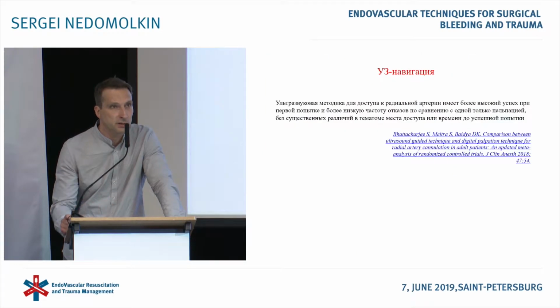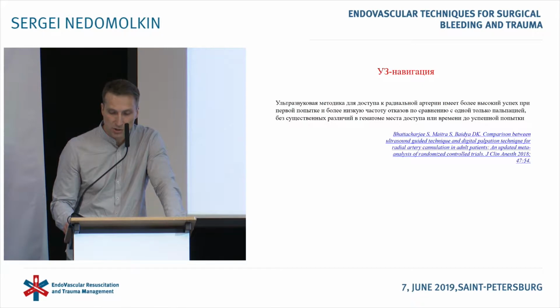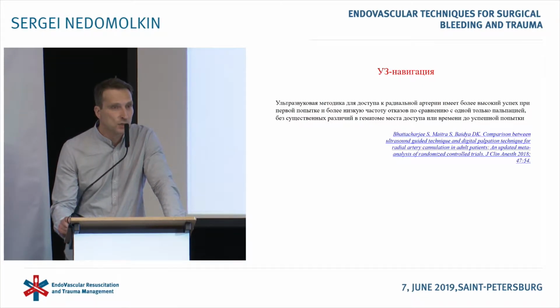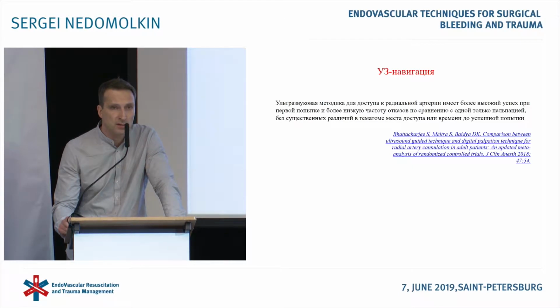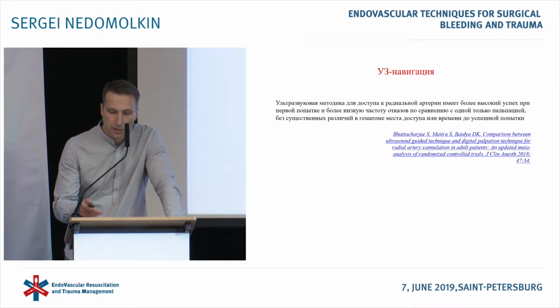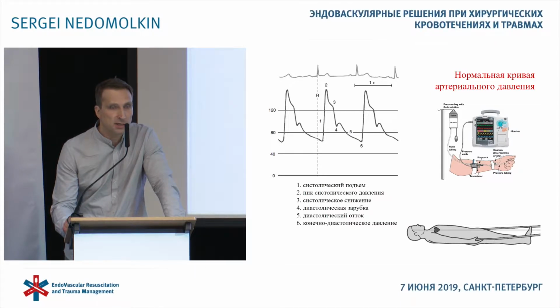But this is possible if a specialist is mastering the technique. If our specialist is more used to palpatory method, of course, he will better do it without ultrasonic control. And ultrasonic navigation, according to the studies, does not lead to the minimization of complications. It can improve catheterization and blood flow only at the primary successful catheterization.